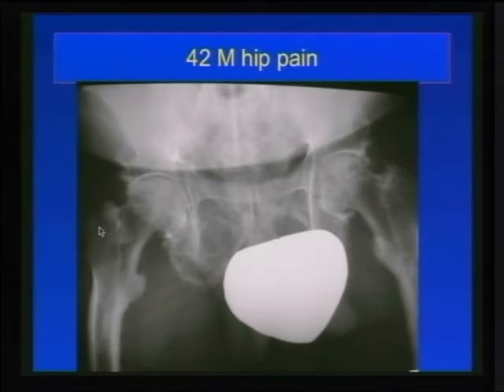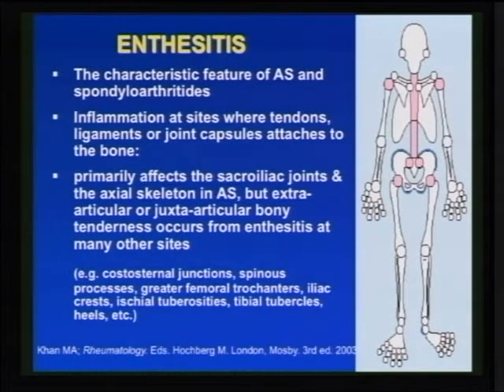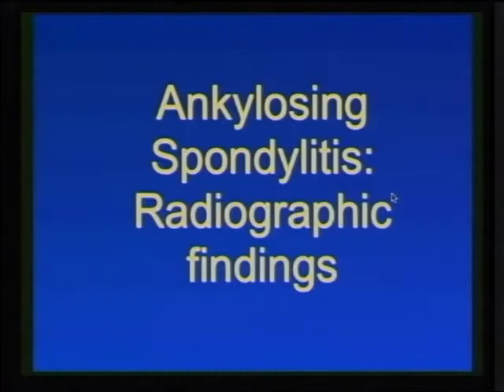So these are the ossification, calcification of the tendinous, ligamentous portion of the bone attachment. This is what we meant about enthesitis. You might see some sort of thing called enthesophyte, especially in the posterior aspect of the calcaneus at the site of attachment of the Achilles tendon. So these are the sites where you really can see enthesopathy or enthesitis.